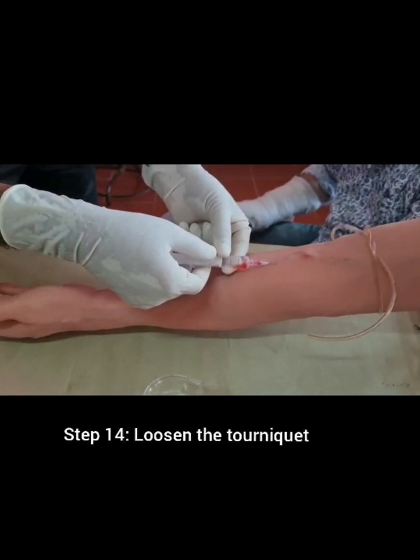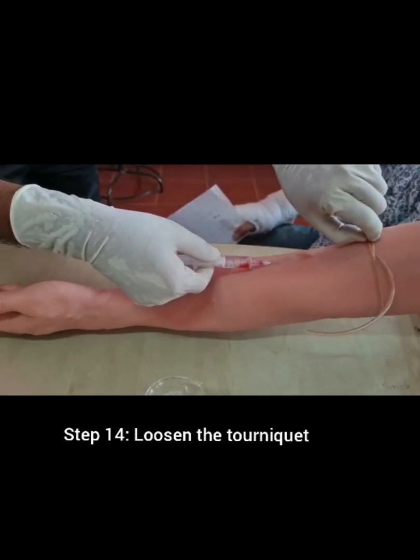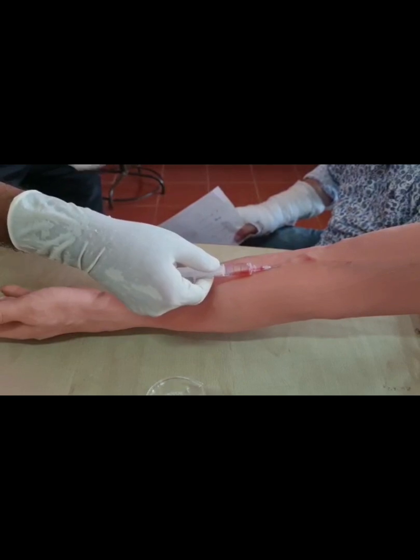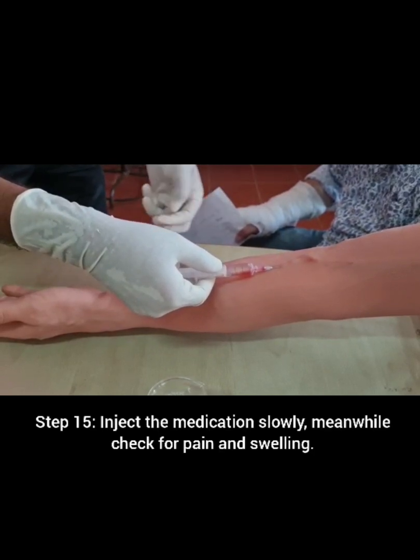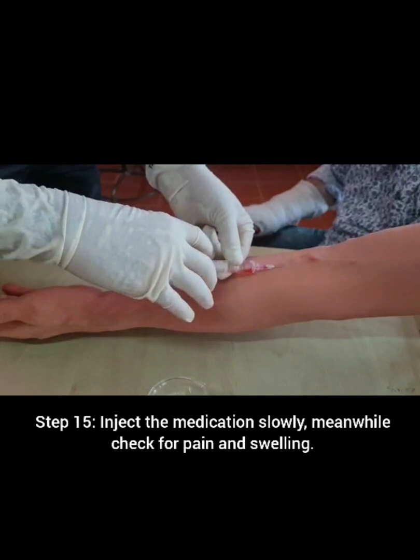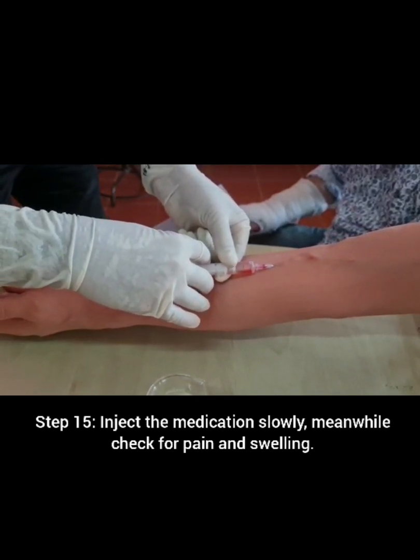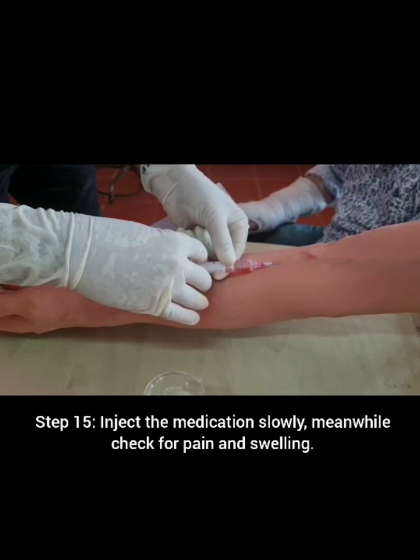Loosen the tourniquet. Inject the medication slowly. Meanwhile, check for pain and swelling.